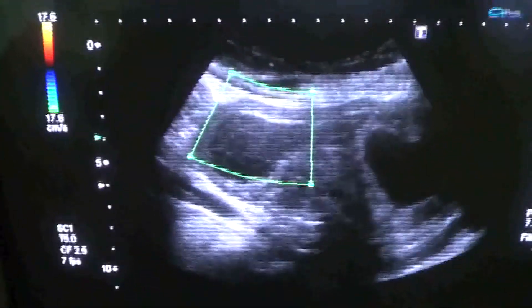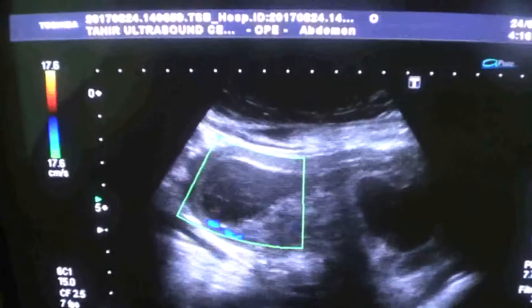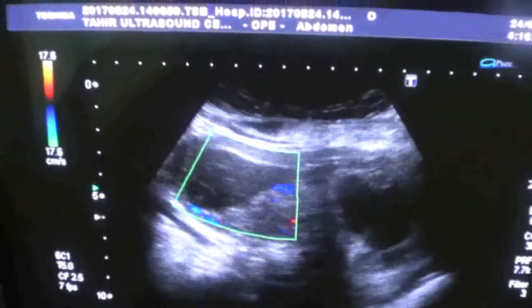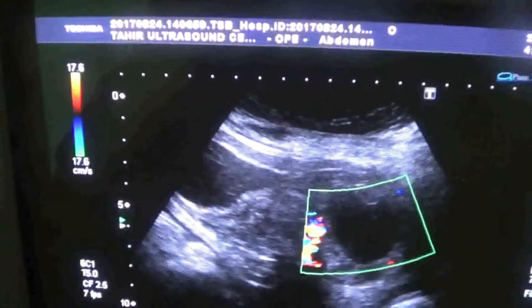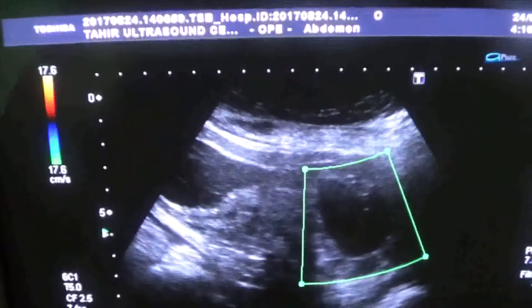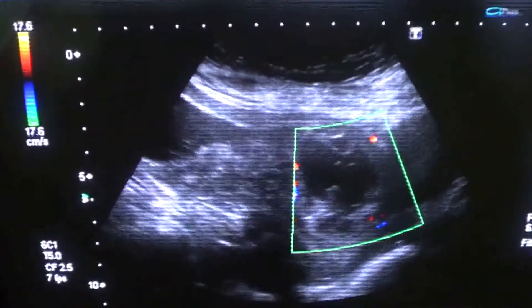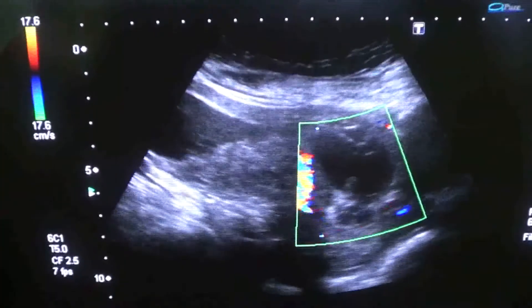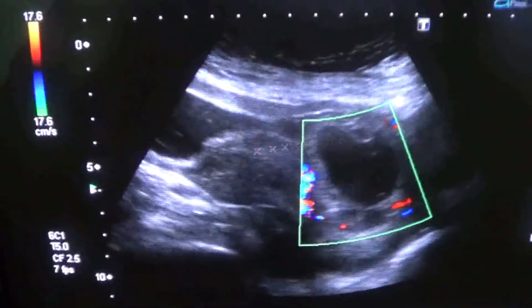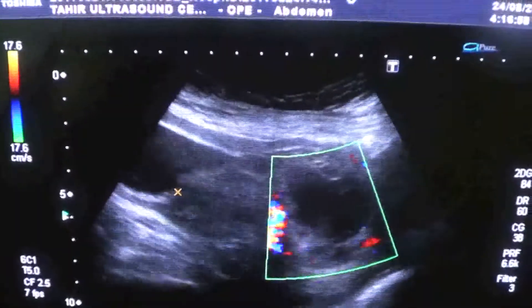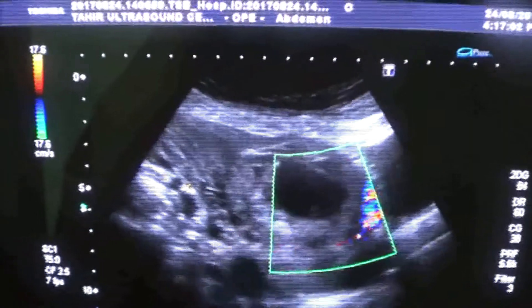Here the rim is thin and there is no significant blood flow to the trophoblast. Moving down to gestational sac number one — we do not see any fetal pole. What you are seeing here should not be mistaken for a fetal pole; this is all debris, as we also saw in gestational sac number two.